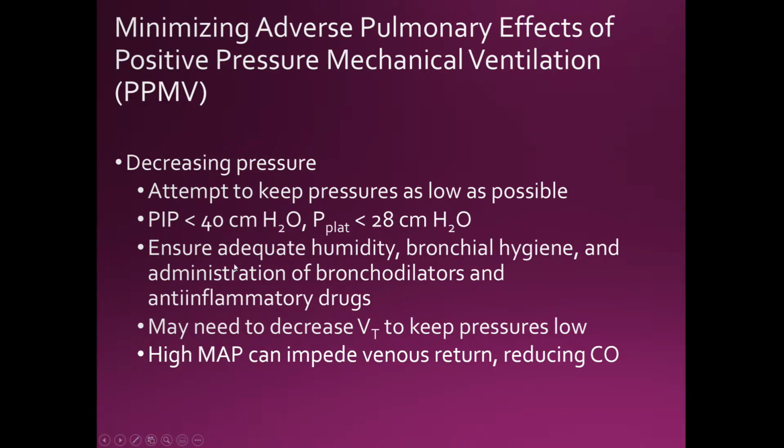Another thing is you want to make sure that you have adequate humidity. You want to make sure that there are, number one, not so many secretions that increase airway resistance, which will increase your peak inspiratory pressure. But you also want to make sure that they are not thick, tenacious, copious secretions. You want them thin enough so that either the patient can cough it out or you can suction it out really easily.